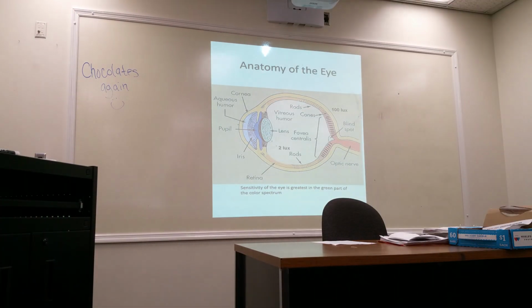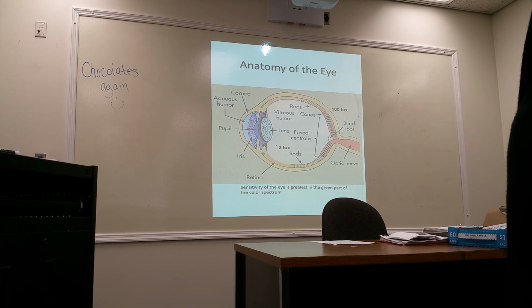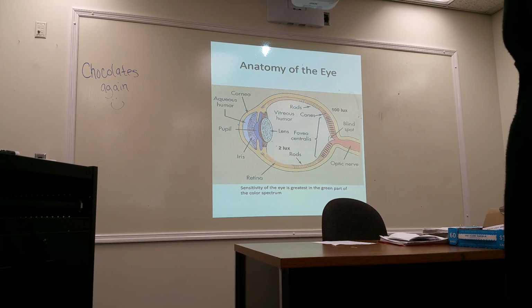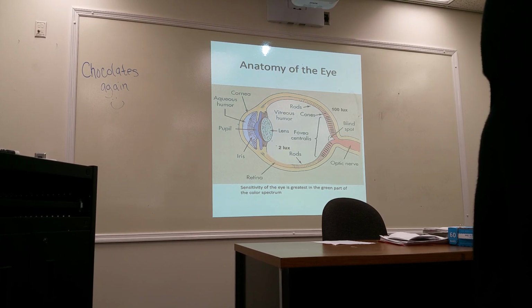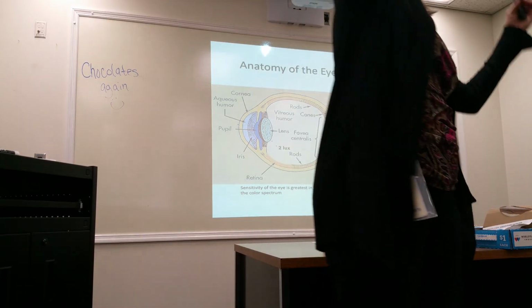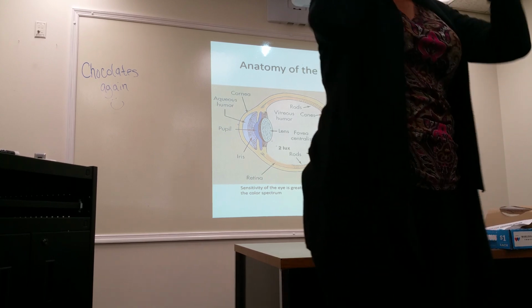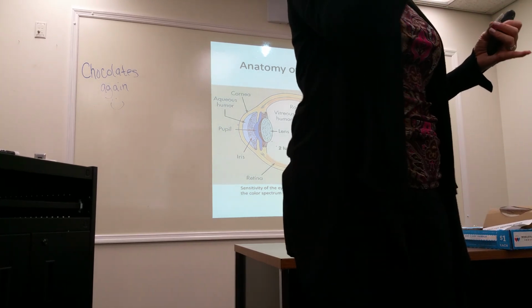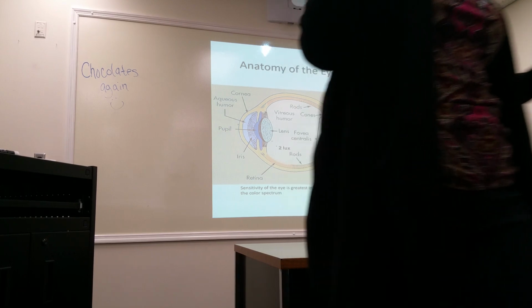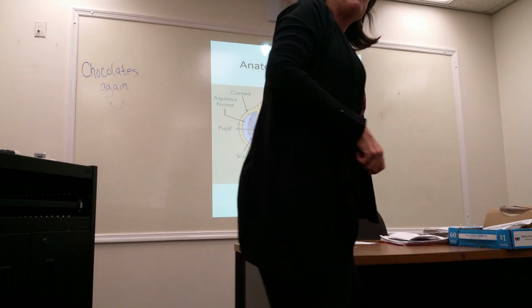That was a problem, remember, everybody? Astronomers do this too. They don't look directly through a telescope at a star. They use their peripheral vision, and that is hard to do. It's a definite technique. So what do you think the problem ultimately is going to be, with the room being dark, having to dark adapt the eyes, and using peripheral vision instead of looking at the screen straight on?